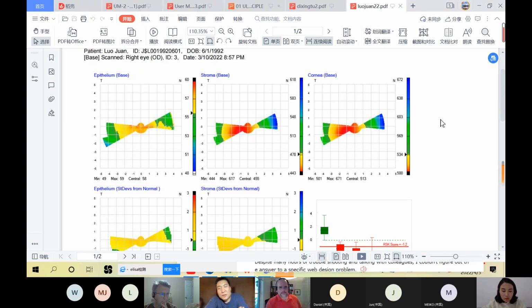Yes, so it's not good. The patient didn't open the eye fully. The eyelid won't be the key. Yes. I know. So we need to find a way to be able to open the eye of the patient.